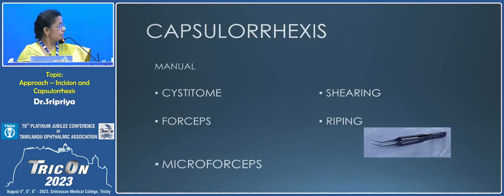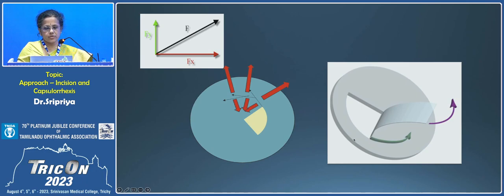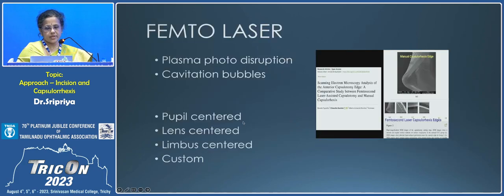You can do capsulorhexis using the manual mode, which is using the cystitome or the forceps or the micro forceps. With the cystitome, it is a shearing force where you run the cystitome parallel to the pupillary margin so that the flap moves around. Whereas with a ripping force, the zonules are pulling to one side and your cystitome is going to pull to the opposite side, like vector forces, so that the rhexis moves tangentially. So as you go around, you have to change the direction towards the centripetal pull every time so that the rhexis forms in the plane that you want.